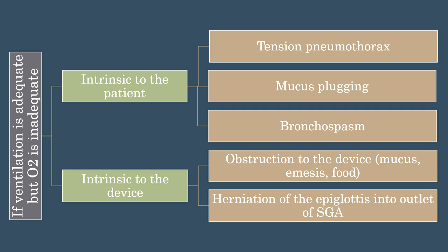The real take-home point here is that this device requires monitoring. Don't place the device and assume that it's working. Always maintain adequate oxygenation for your patient. And if the supraglottic device isn't providing this, you need to pull the device and try something else.